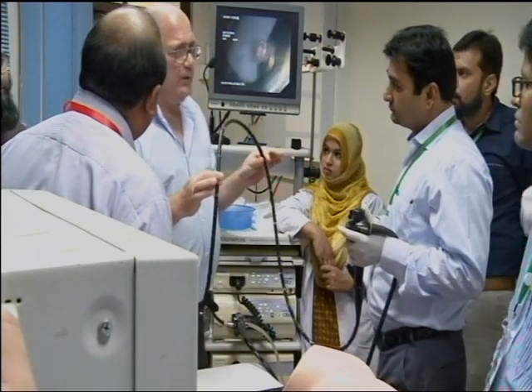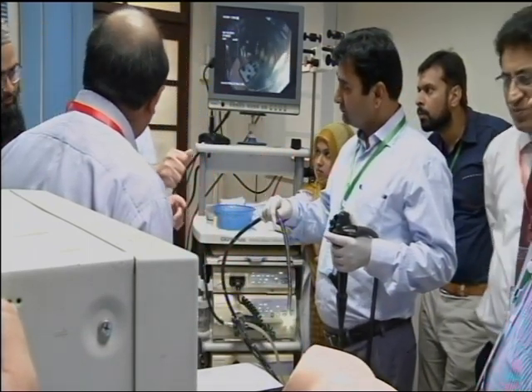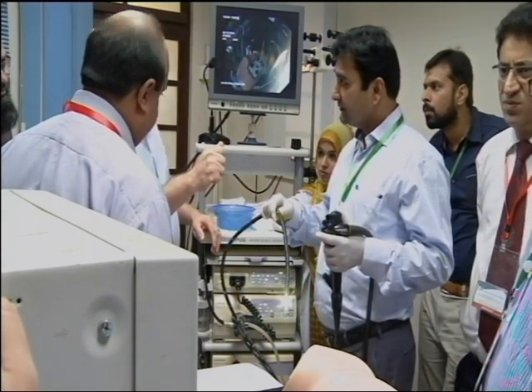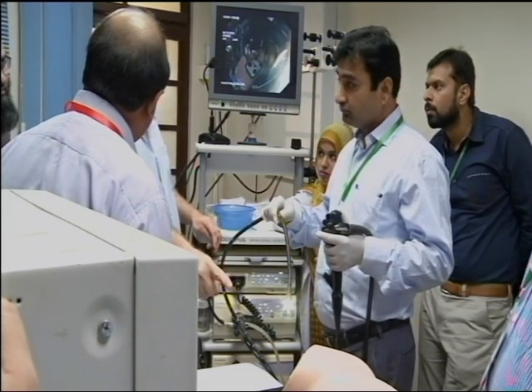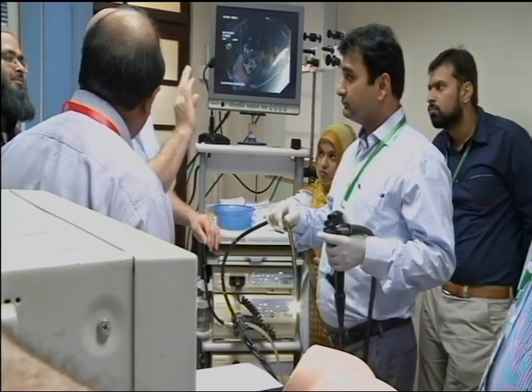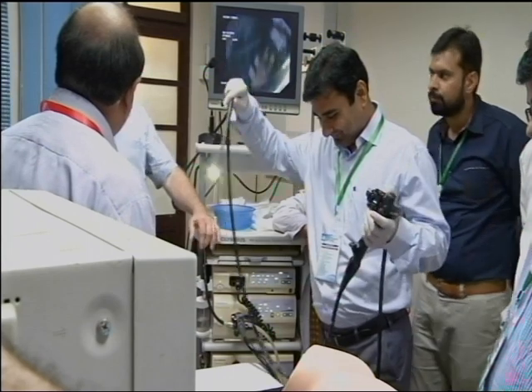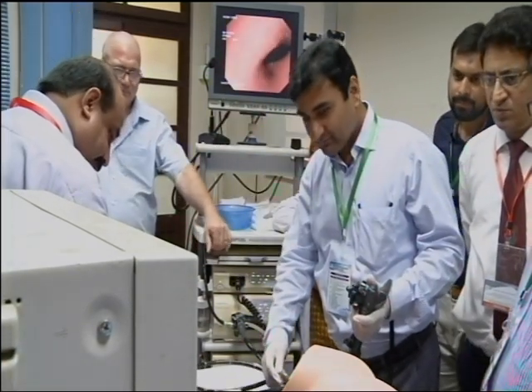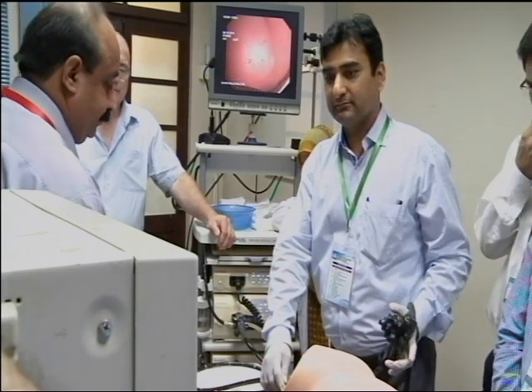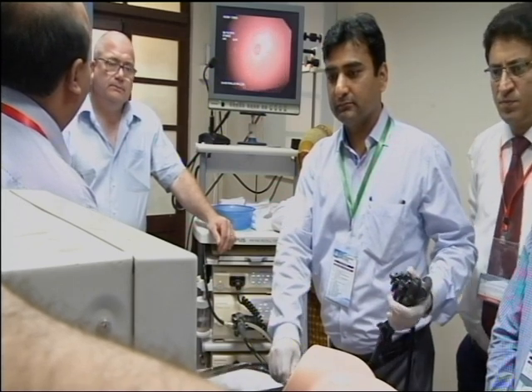So, what were you doing with the scope? You can put it back in now. You were gripping the scope. So, did you feel the tension that was in the scope when you gripped it tight? Just imagine that in the bowel. It makes the bowel suddenly go, ooh. Caress the scope. Relax. Good. Slow down.